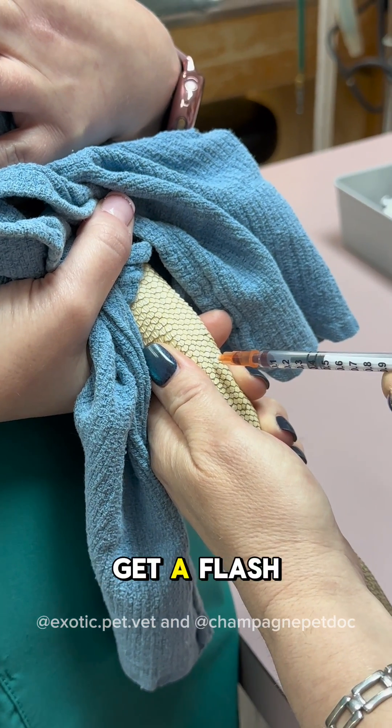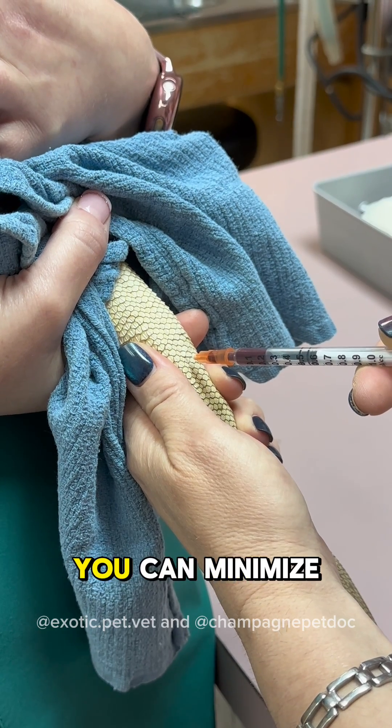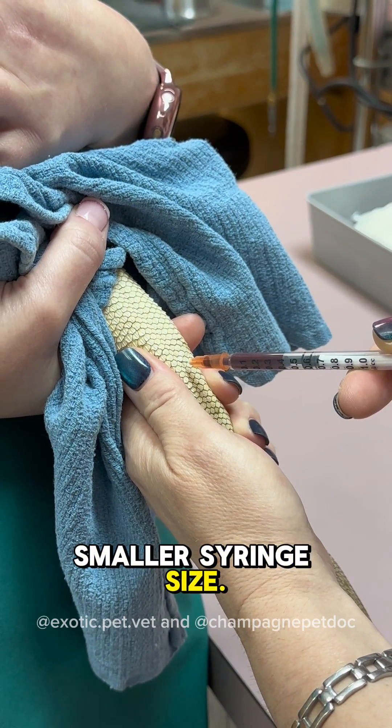One mistake that people make is that when they get a flash, they pull back too hard on the syringe, which collapses the vein. You can minimize this risk by only using gentle pressure and using a smaller syringe size.